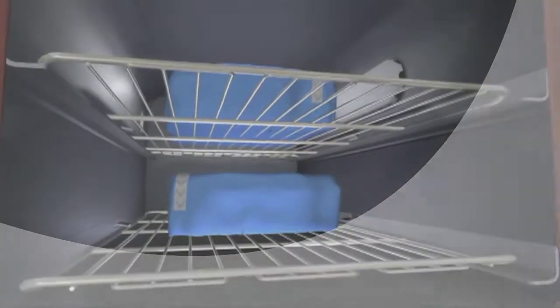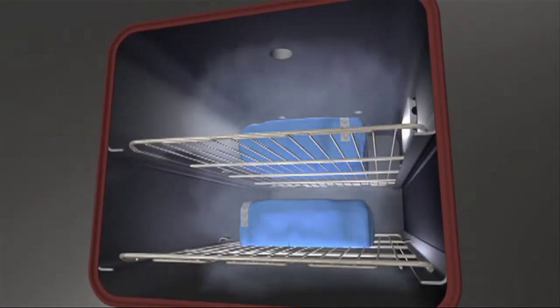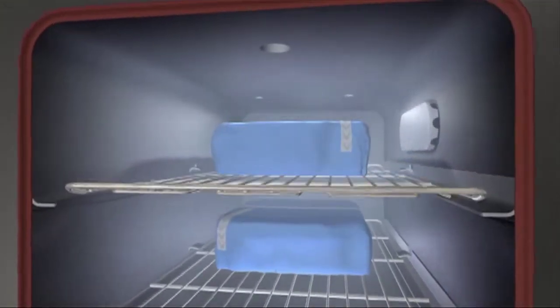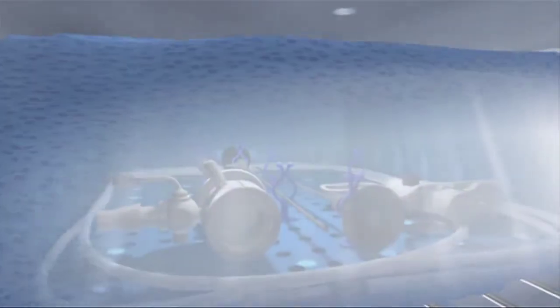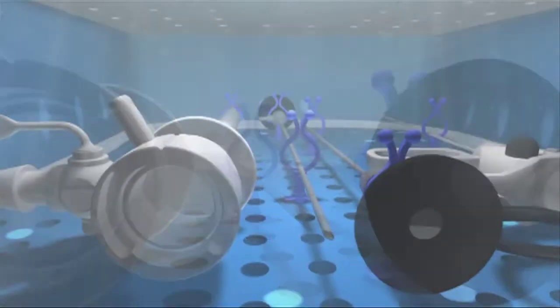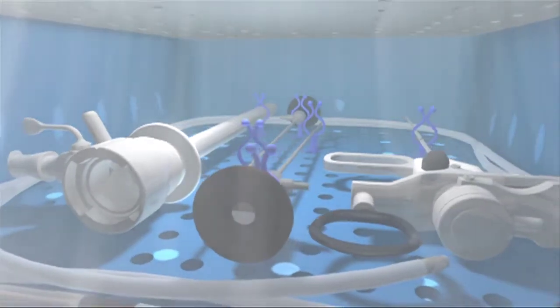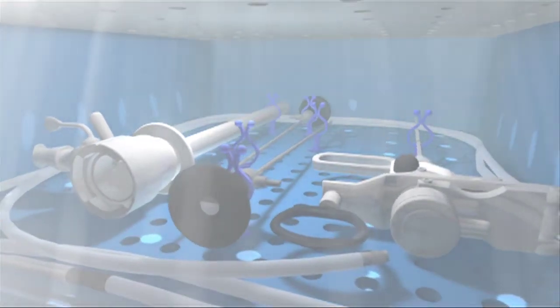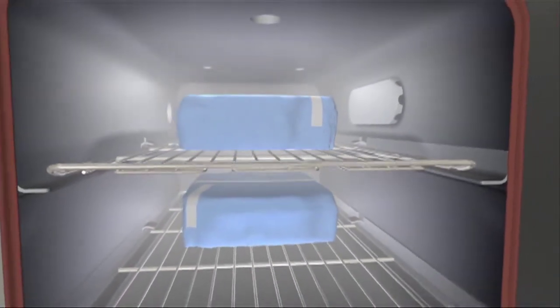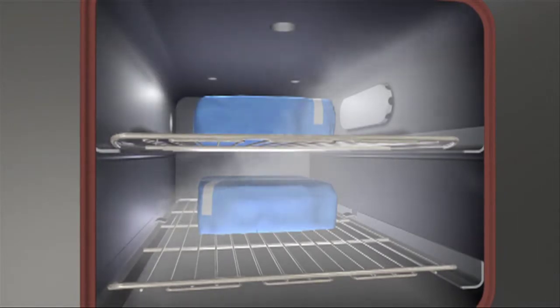The V-Pro Max sterilizes with 59% hydrogen peroxide throughout each cycle, versus other sterilizers that concentrate sterilant up to 94%. The lower concentration of hydrogen peroxide in the V-Pro Max reduces the risk of device and instrument damage. Low sensitivity to moisture minimizes aborted cycles, which saves time and money, and enables reliable device turnaround.